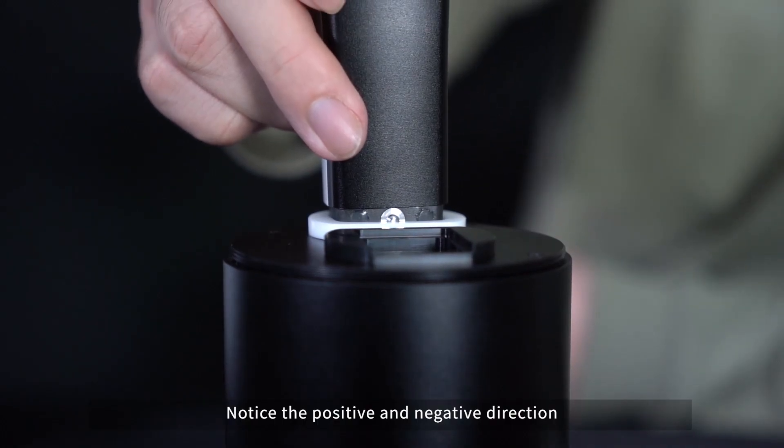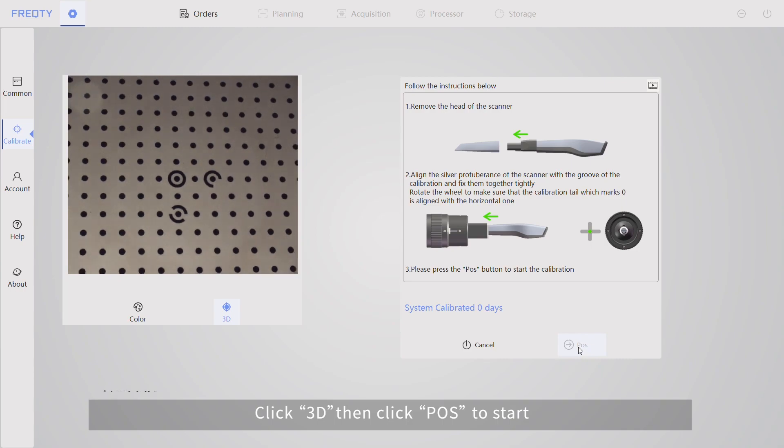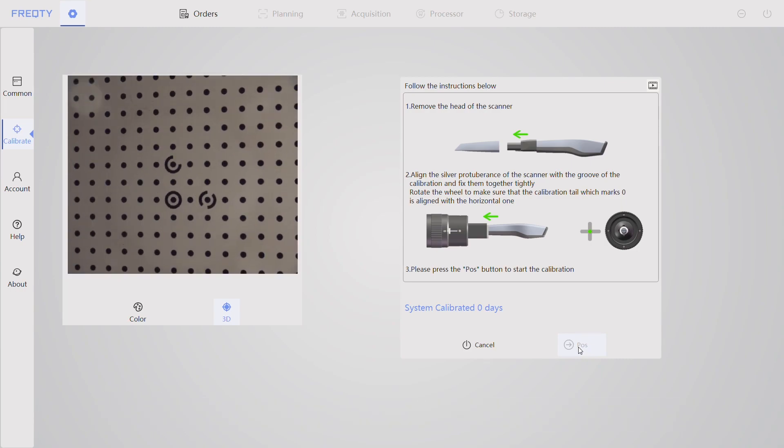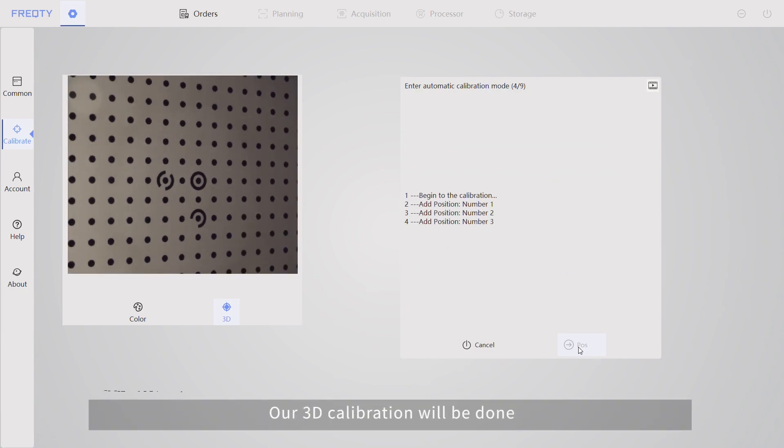Notice the positive and negative direction. Click 3D, then click POS to start. Wait for a while, our 3D calibration will be done.